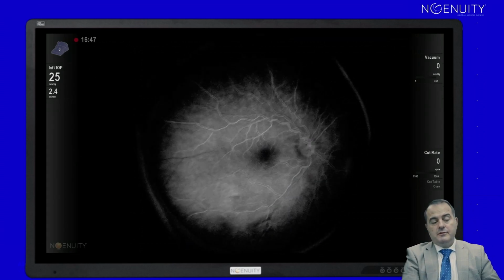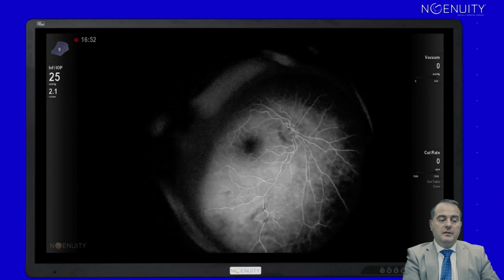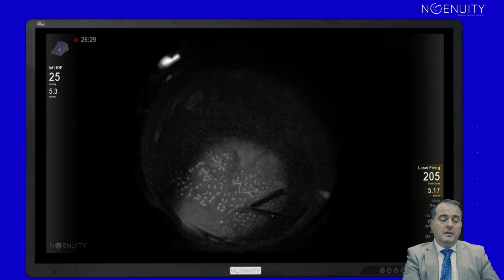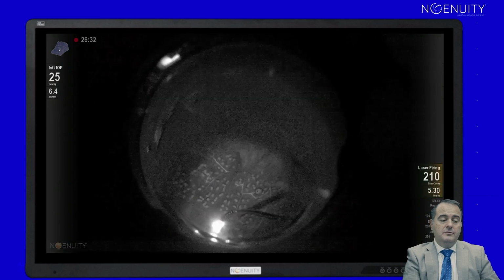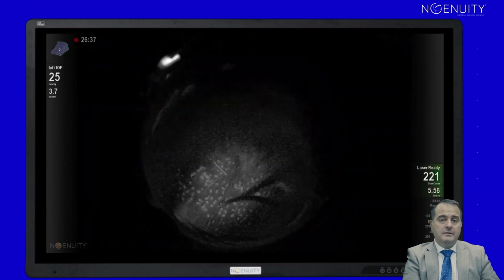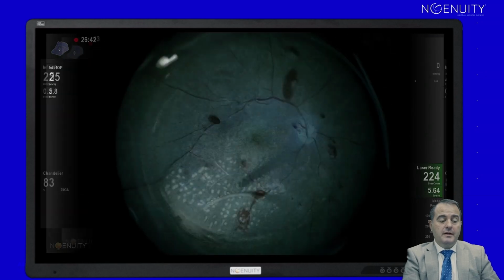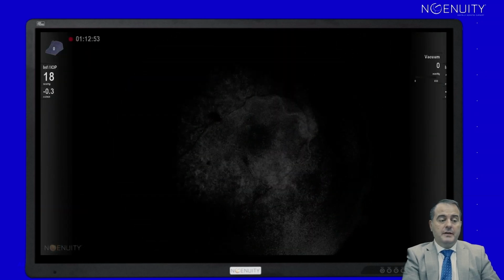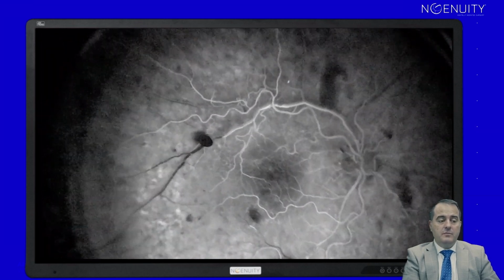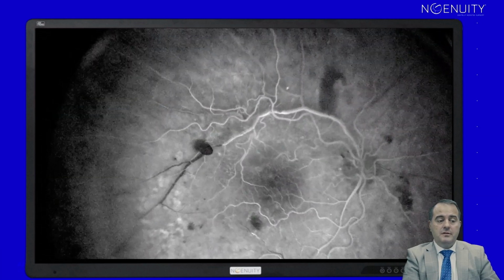And this is something which we are doing from 2 years already. It's intraoperative fluorescein angio in a case of branch arterial occlusion. And you see that we are able to do intraoperative fluorescein guided endolaser. So we can selectively treat only the areas which are without perfusion, and we can save more of the remnant healthy retina. Here you can see a phenomenon of embolus passing and venous congestion without any perfusion in diabetic eye.